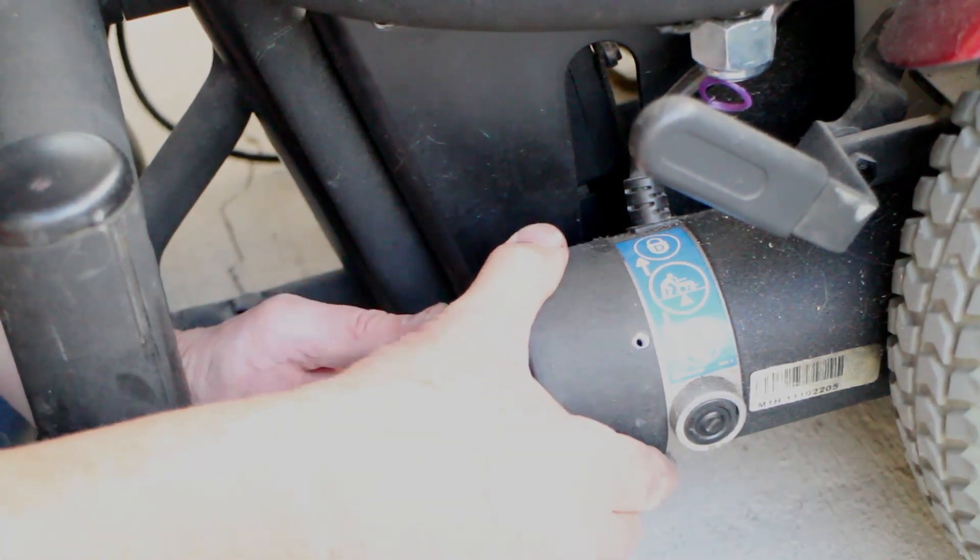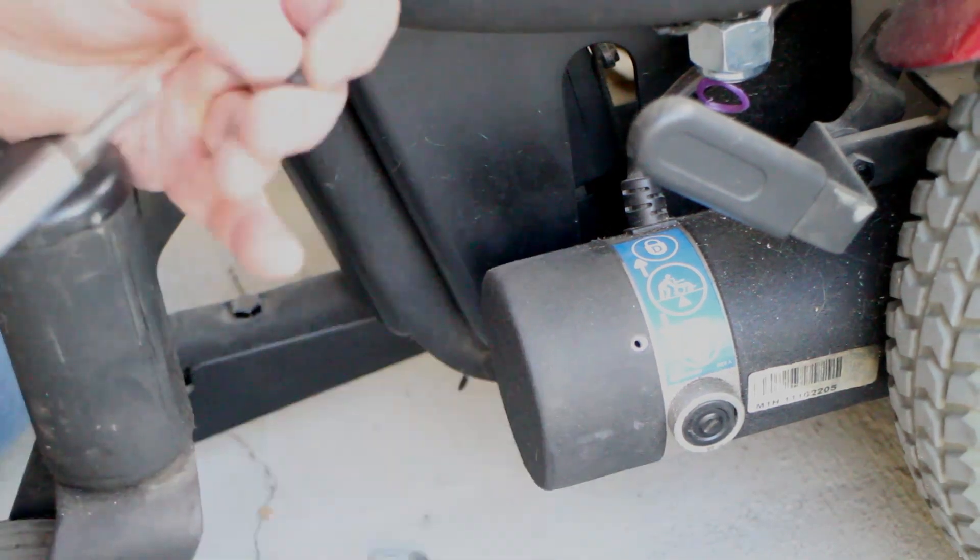Then it simply was a matter of replacing the cap and reinstalling the two cover plate screws. All in all, the job was done in less than five and a half minutes for each side. Now on to the next step of the process.